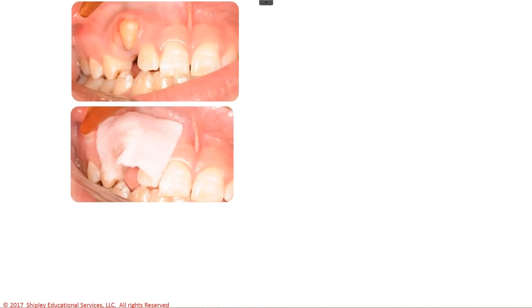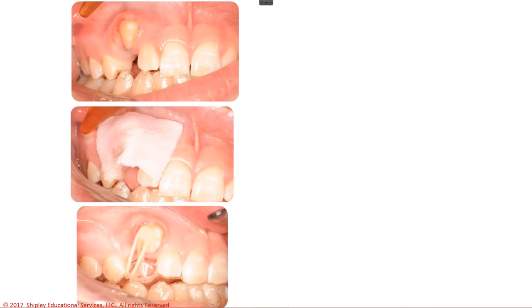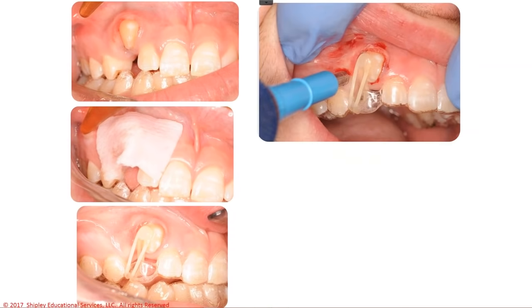You can also see that the gauze is soaked, so we didn't have cheek retractors in. The gauze is soaked with saliva, which means the topical is diluted and it's all over the mouth, which gives a bad experience for the patient. Well, one thing done right here is we rinse the topical off during that extra 10 minutes. We do the mechanics of the day, which is putting the bootstrap on, and then we do the propel.